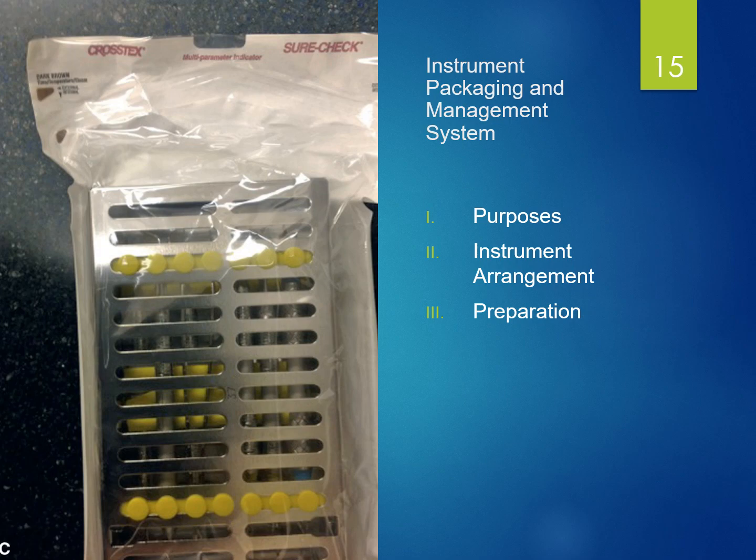Cassettes can be either wrapped or packaged in the see-through packaging systems, and then it's going to be usually a steam type of. Be careful that these are not punctured. If there's any type of puncture in one of these packages, then it renders it very quickly into a non-sterile type of package, and it would need to be re-sterilized before use on a patient.